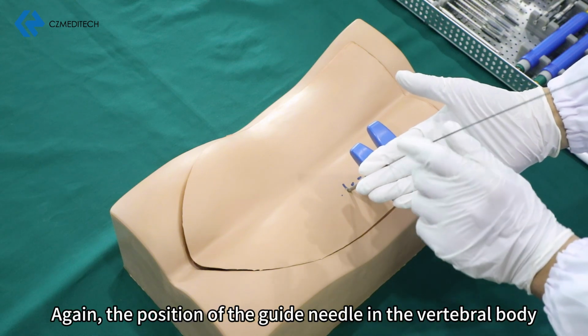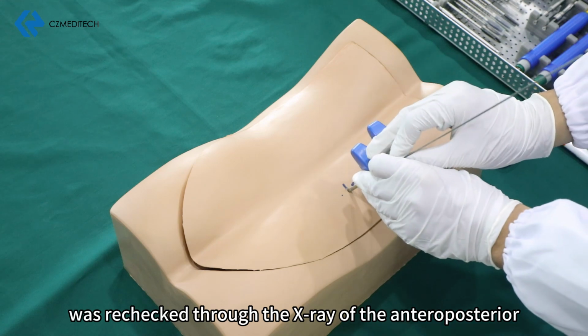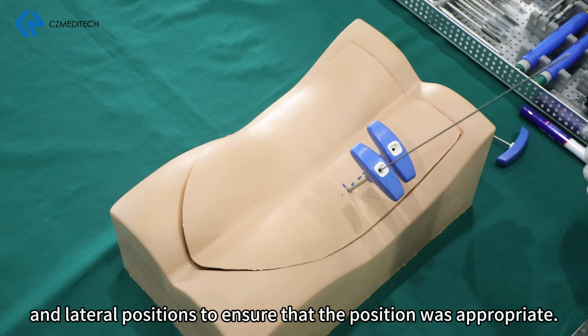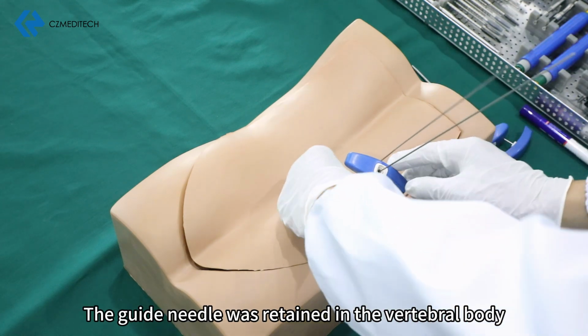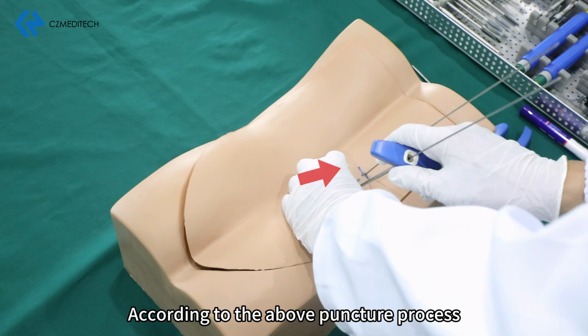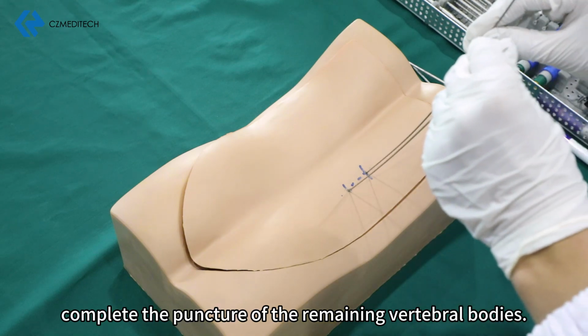Again, the position of the guide needle in the vertebral body was rechecked through the X-ray of the antero-posterior and lateral positions to ensure that the position was appropriate. The guide needle was retained in the vertebral body, and the puncture needle tube was taken out. According to the above puncture process, complete the puncture of the remaining vertebral bodies.